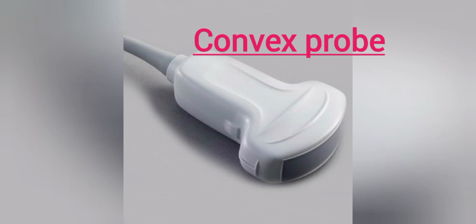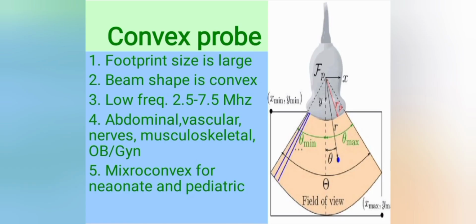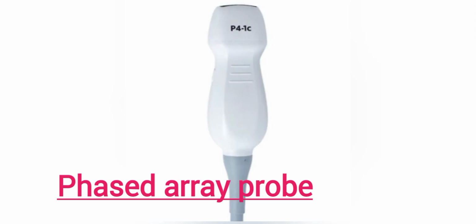Second type is convex probe. This is also called as curvilinear probe. Footprint size is large, beam shape is convex. They work on low frequency, that is 2.5 to 7.5 megahertz. I want to note one thing, that low frequency probes are very good for in-depth examination. That's why convex probes are used for abdominal, vascular nerves, musculoskeletal, and obstetric gynecologic ultrasounds. There is a microconvex type also available with very small footprint, which is very useful in neonatal and pediatric ultrasounds.